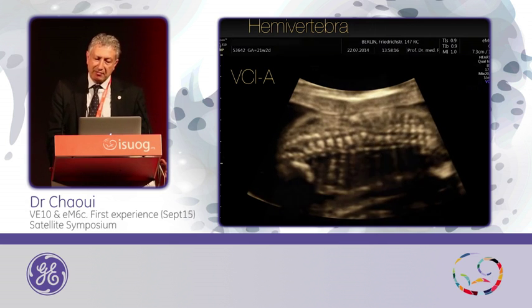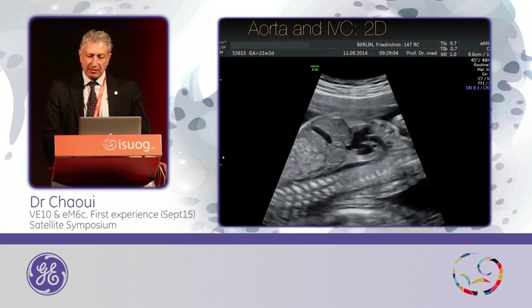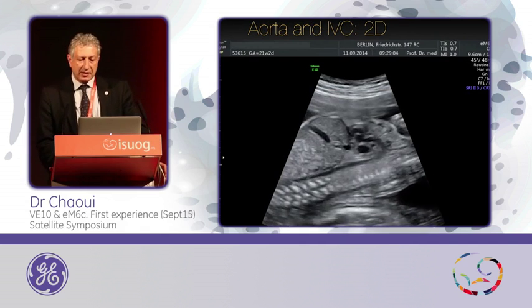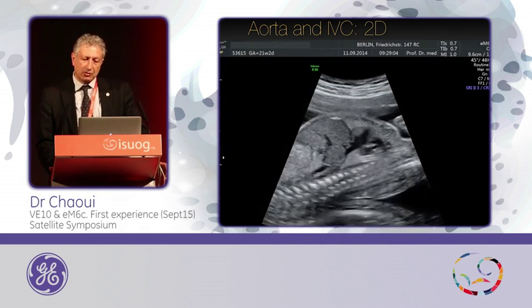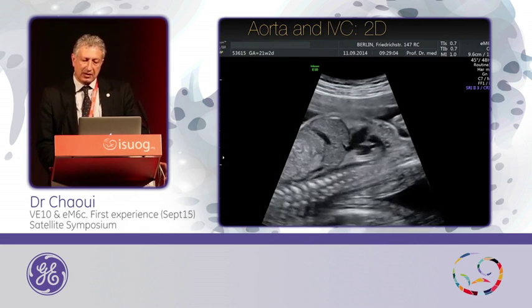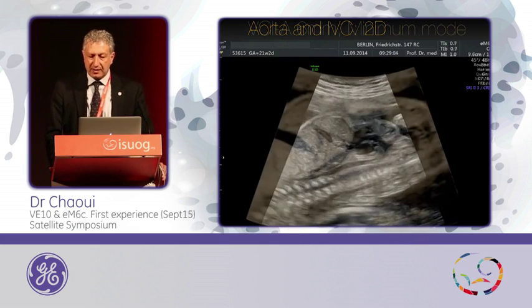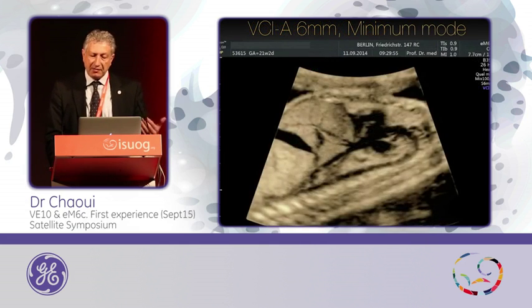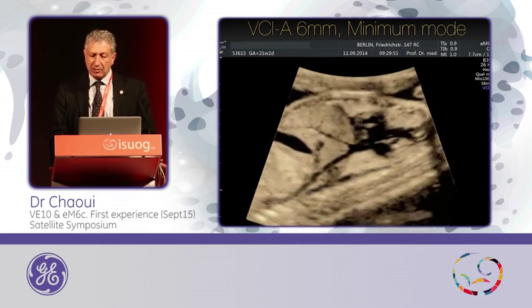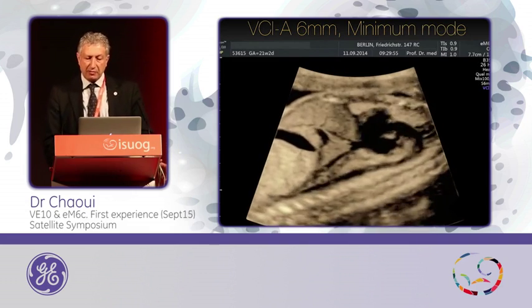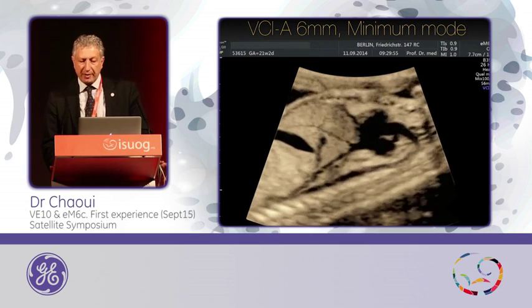I'll show an example which illustrates things well. This is a descending aorta seen on the left side of the body. If you go to the right side, you see the inferior vena cava. Both are not in the same plane. If I take a slice and make a kind of projection in minimal mode, I can show both together within one picture.